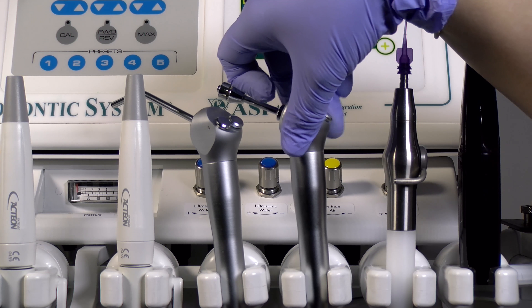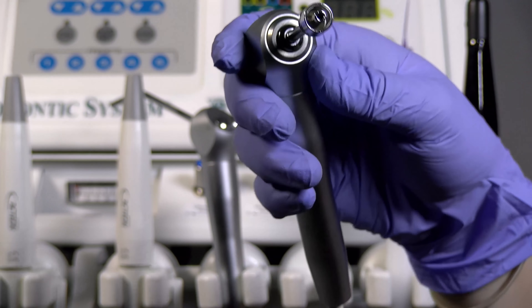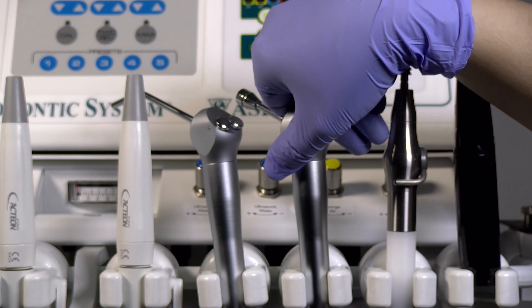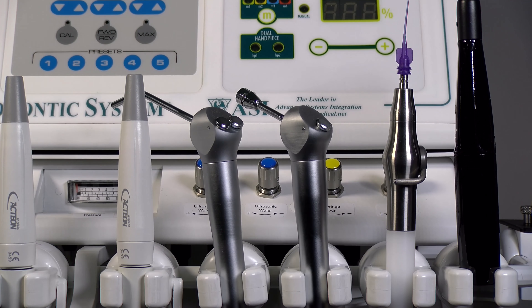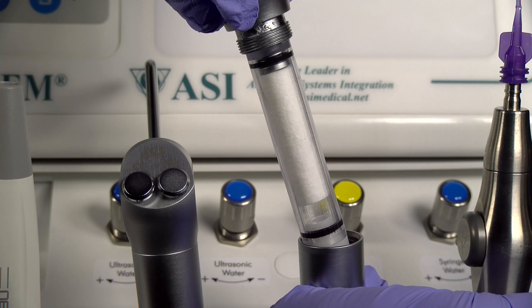ASI's air water syringe is a smooth aseptic type body with quick tip release and can be easily converted for common brands of disposable tips. The advanced dental system features a high flow air only bonding syringe with internal drying filter to aid in moisture removal from the air stream.